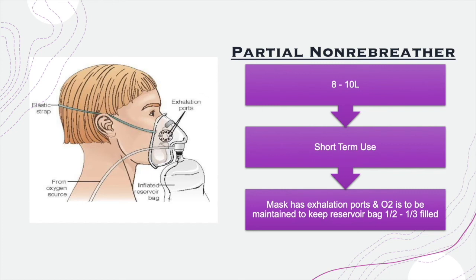Now, for partial non-rebreather masks, there's also a reservoir bag that is attached to it, and oxygen is to be maintained to keep the reservoir bag half to 1/3 filled.